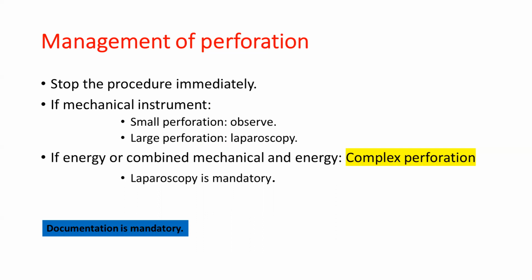If you are using combined mechanical and energy, or energy alone, this is called complex perforation. This is an indication for laparoscopy because the energy can cause damage to one of the vital organs or the bowel, and this injury can be early or remote, leading to problems. So you have to check the integrity of the vital organs and bowel.